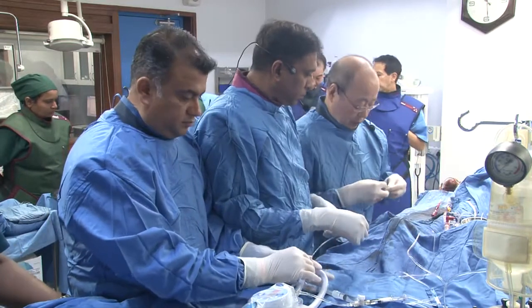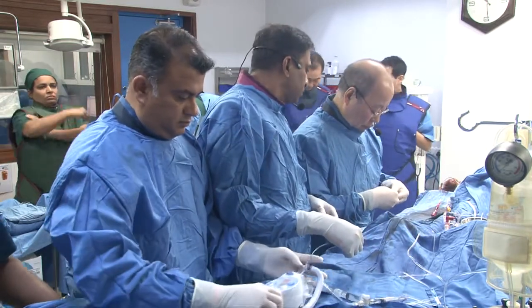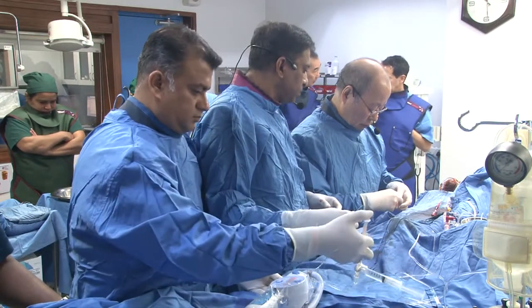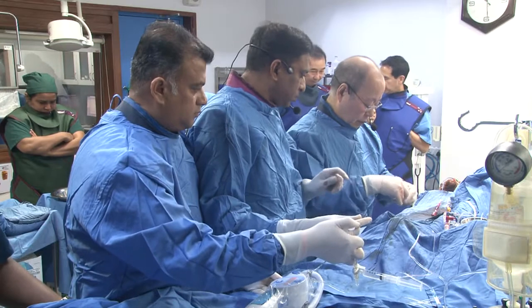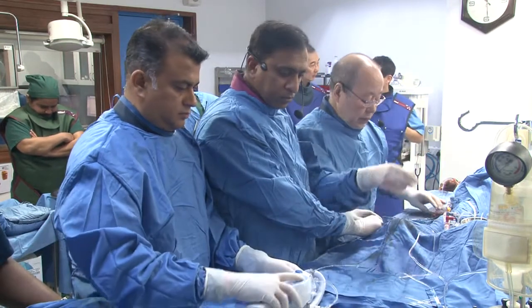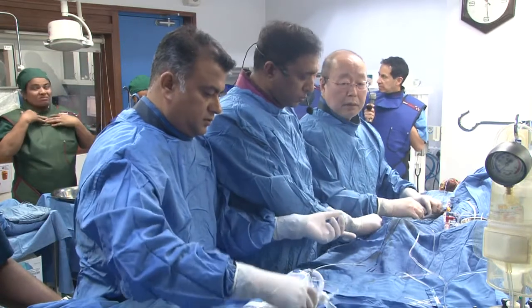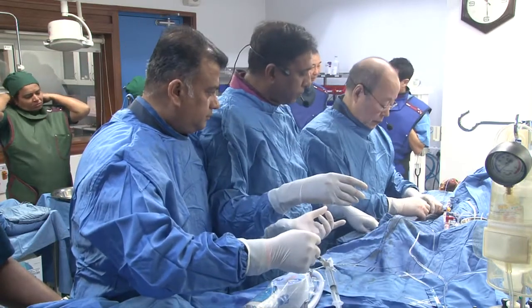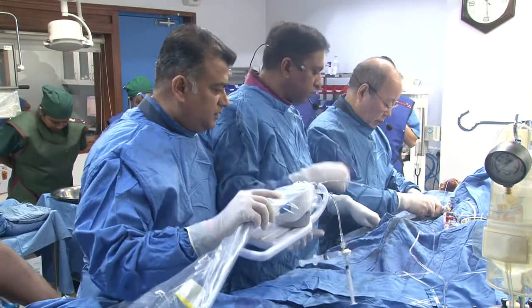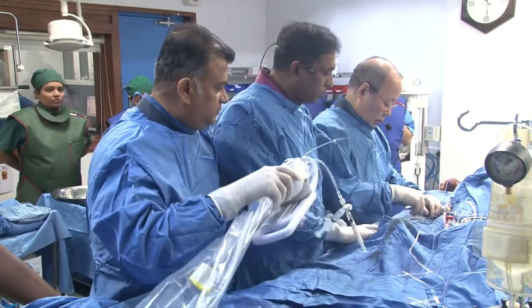But I think your point is a good one. In the old days, we would say subintimal passage or intimal tear was a contraindication to atherectomy, but nowadays it's clearly not, and we have no problems doing atherectomy. Do you agree, Tak, and the panel? You're not put off by some subintimal passage and intimal dissection?